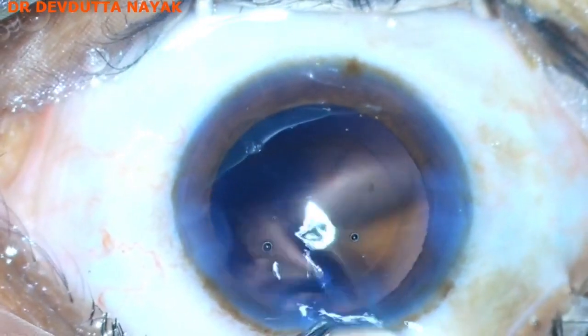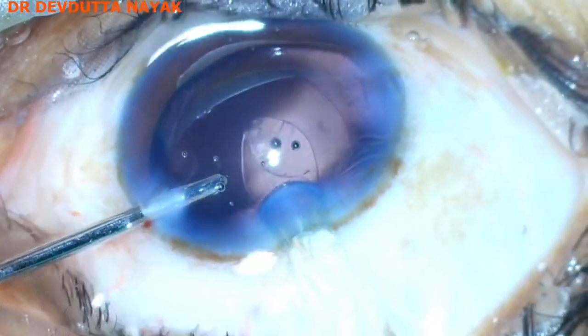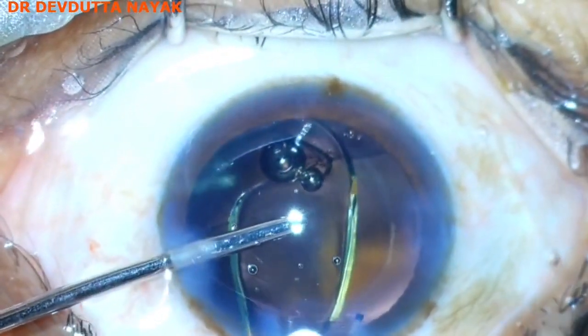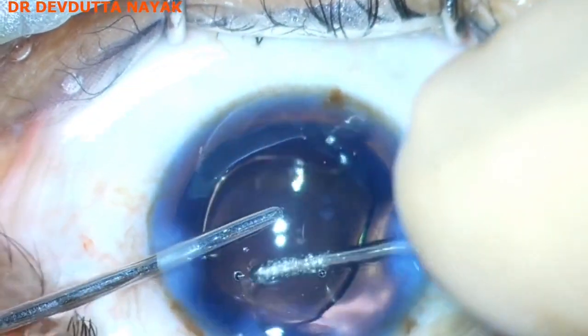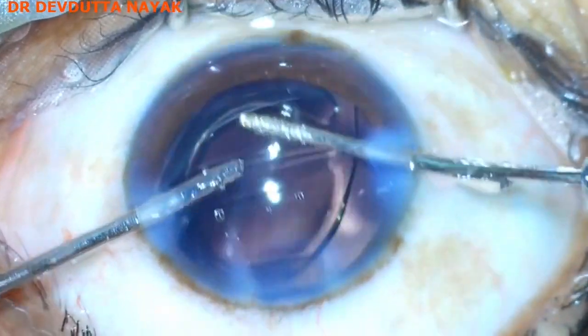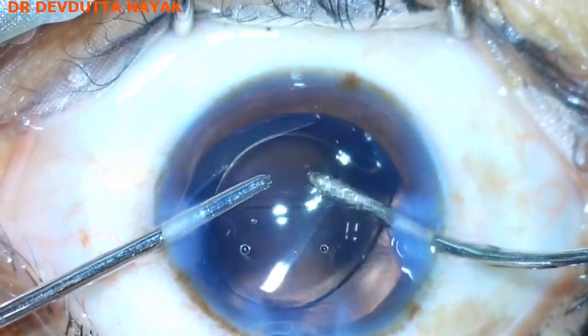A single-piece hydrophobic acrylic intraocular lens is being implanted into the bag. I prefer to implant the lens under viscoelastic. Now the lens is in the bag and OVD removal is being done.